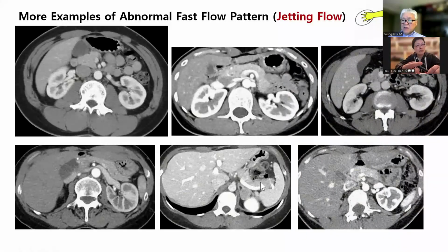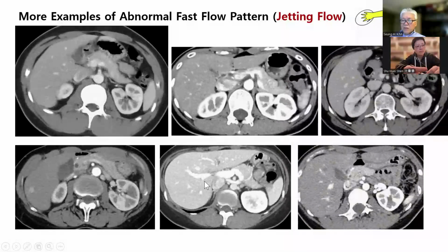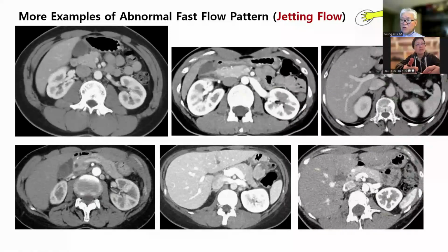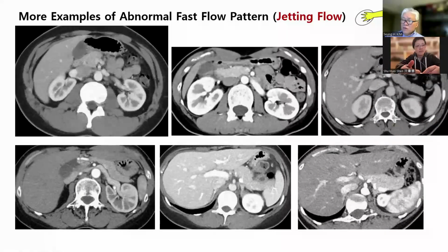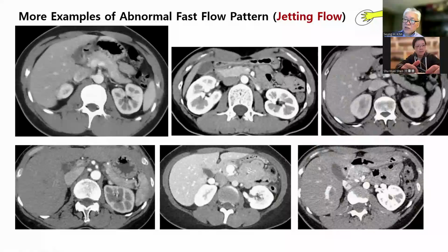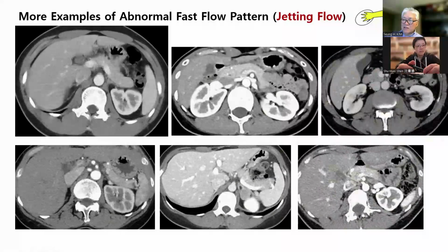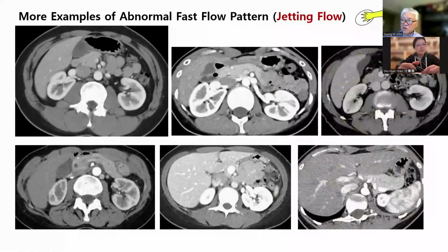The difference is that in this patient we do the CT exam with the patient holding their breath, usually in inspiration. And with Doppler ultrasound and patient respiration, in inspiration the compression is the weakest, and in expiration the compression is strongest.